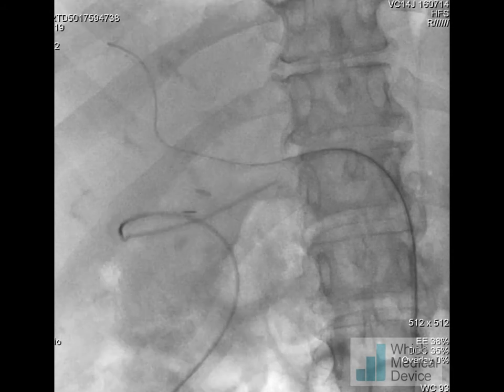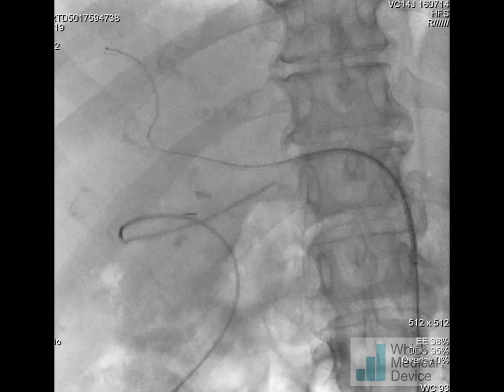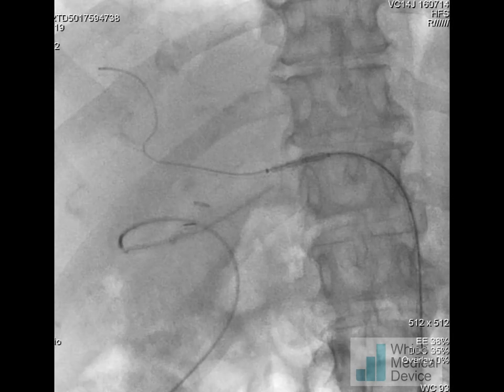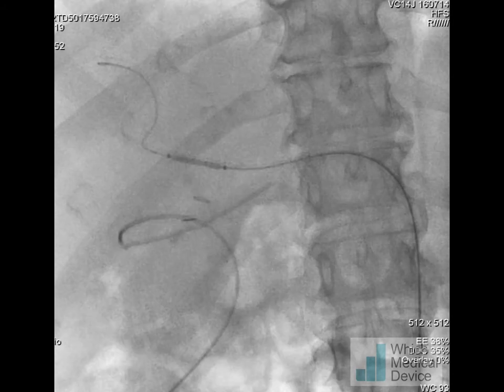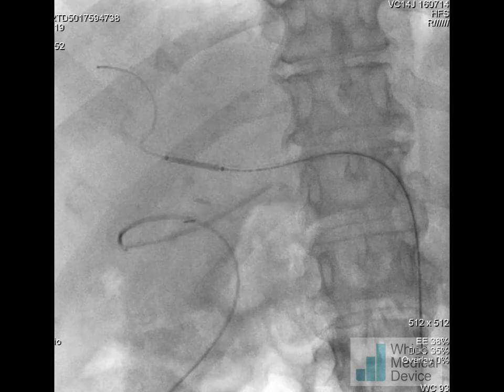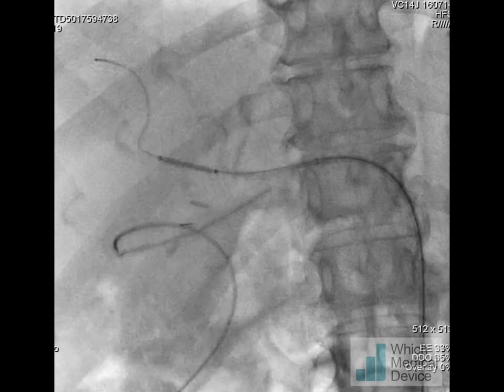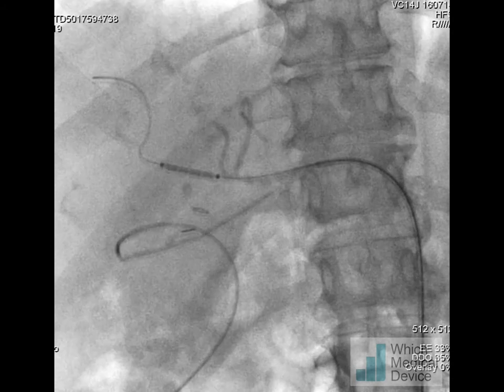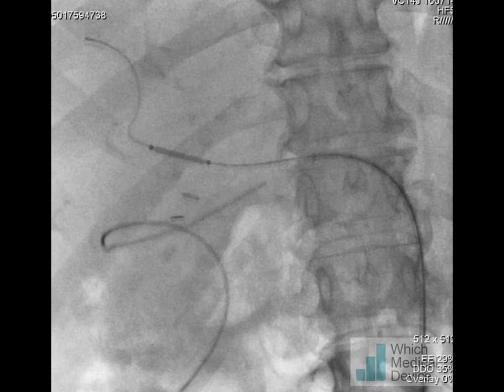Here you can see the stent being passed up through the destination sheath. It's balloon-mounted and tracked very easily through the sheath and along the right hepatic artery. You can see a small amount of residual contrast in the pseudoaneurysm to confirm correct position, and we can further confirm that by injecting contrast through the sheath, showing it's not covering any of the right hepatic artery branches.